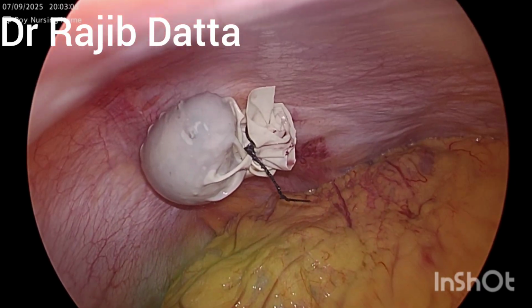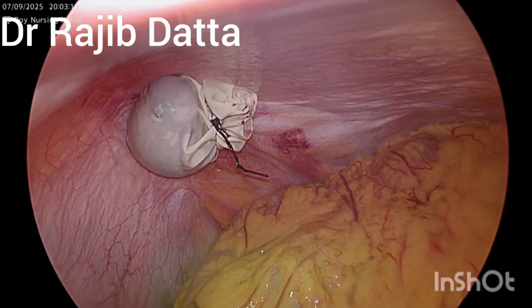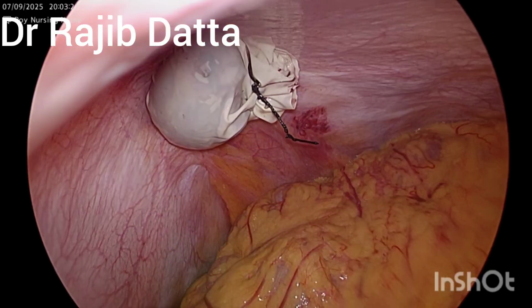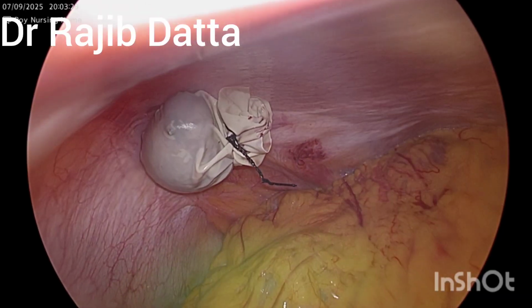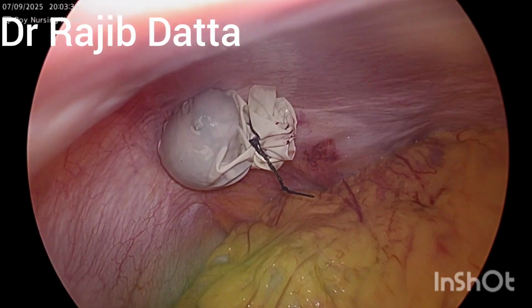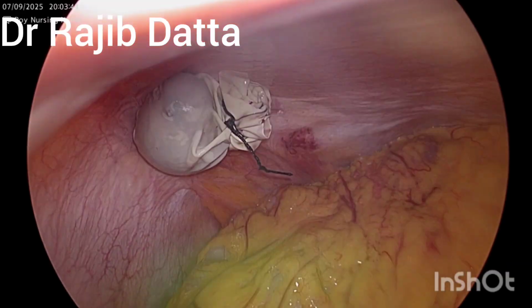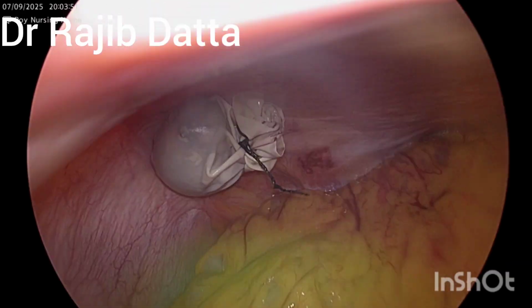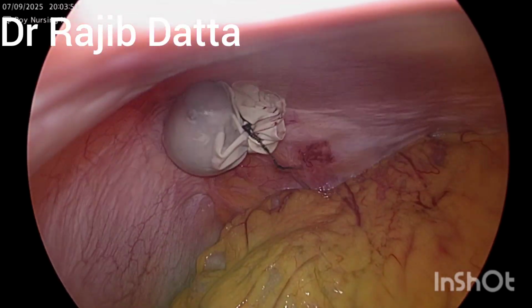retrieve it out. The patient has a previous history of cesarean sections, so you can well appreciate the scar, and there are some adhesions also. The patient has a history of lower abdominal pain and a previous history of uterine fibroid that was removed during cesarean section and delivery of this baby.